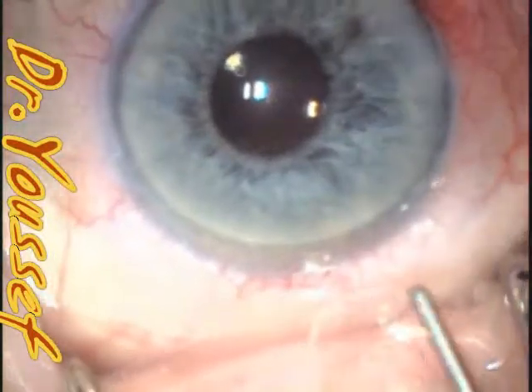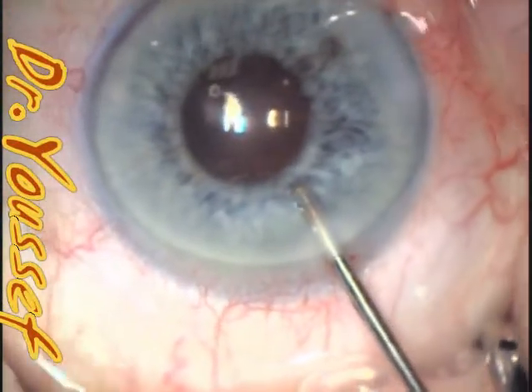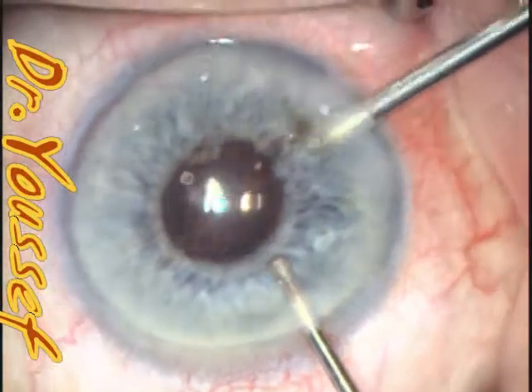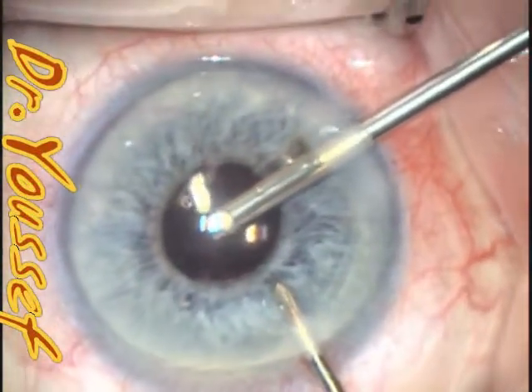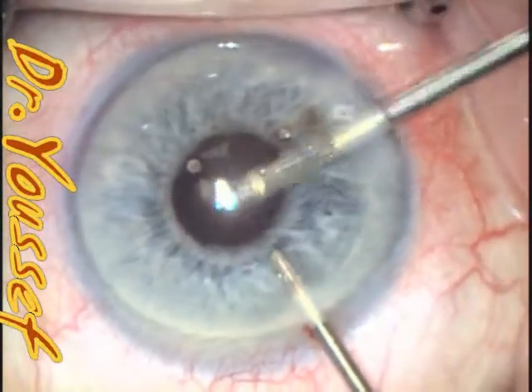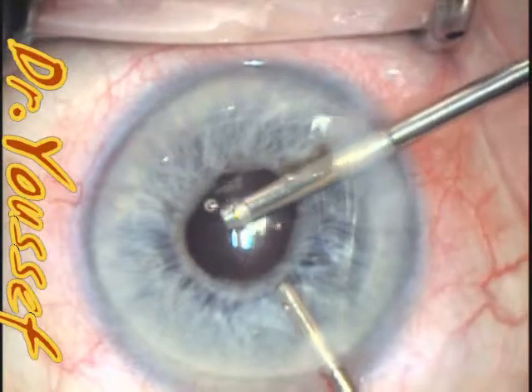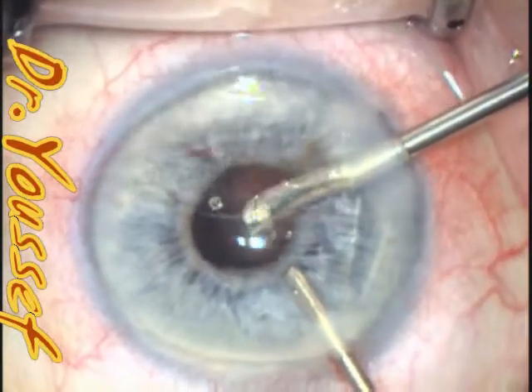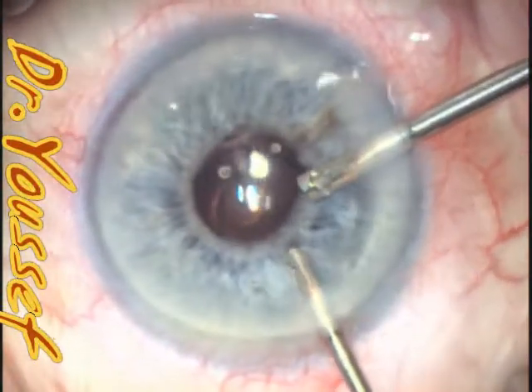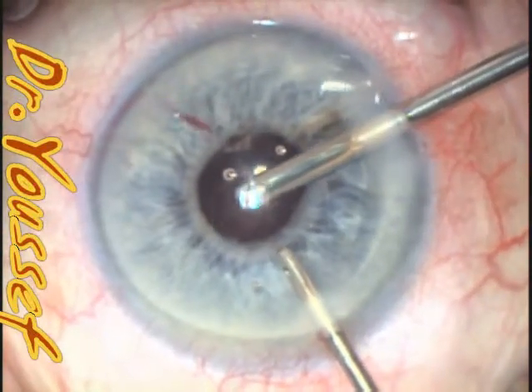You can see that the pupil is central and rounded well. I use the bimanual vitrectomy. The vitreous is coming from very far in the nasal part, so it's okay to use the main incision. So I'm doing anterior vitrectomy. It's well centered, and the pupil is regular. There's no major problems here.